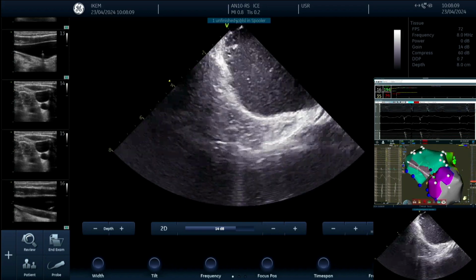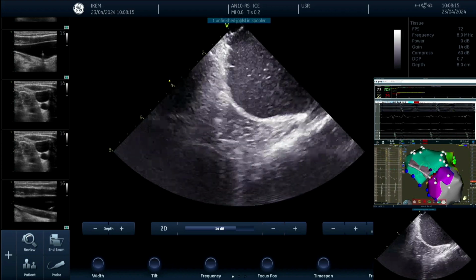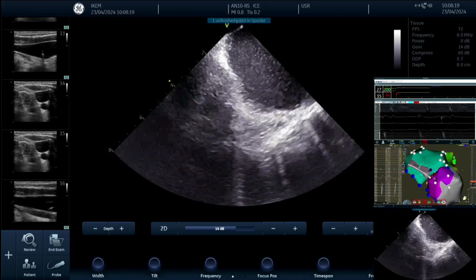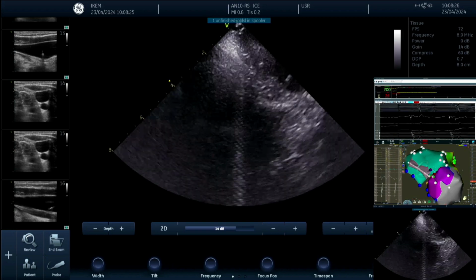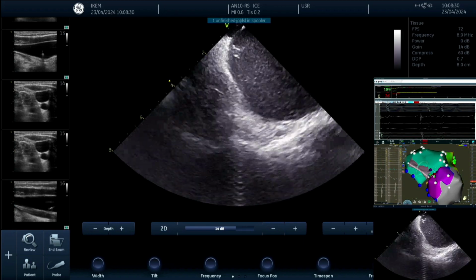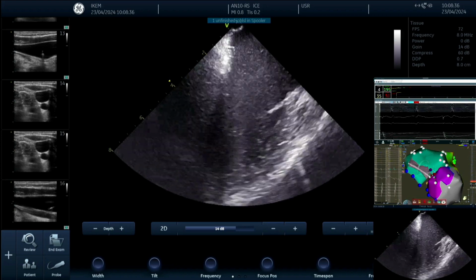And there is one randomized trial which is called BEAT-AF. This is a European grant which is administered through Bordeaux. And both our centers are part of this study, and that's a randomized comparison of pulsed field ablation with Farapulse technology versus state-of-the-art SmartTouch with contact force sensing, point-by-point ablation.